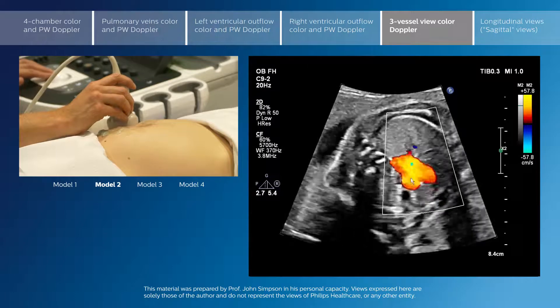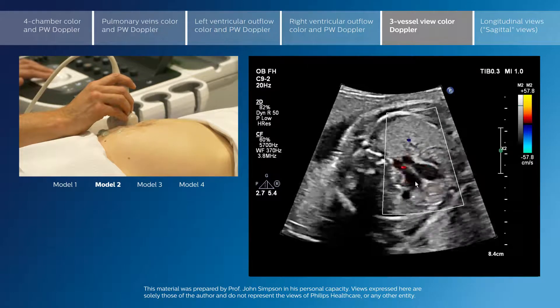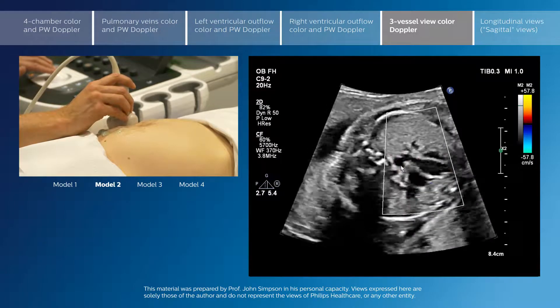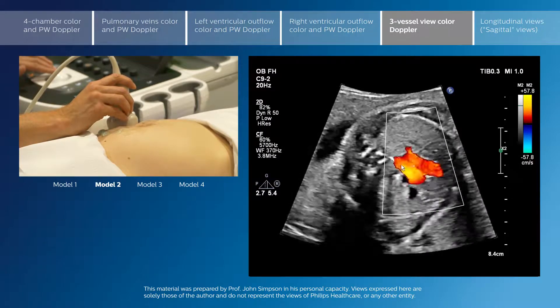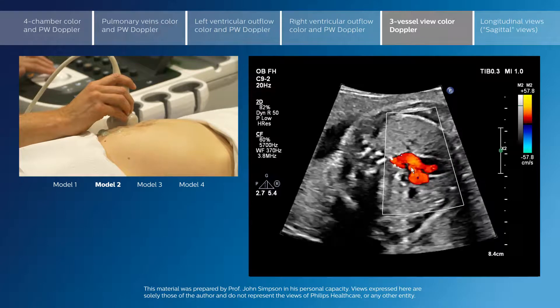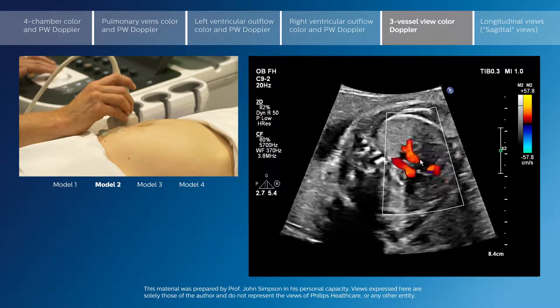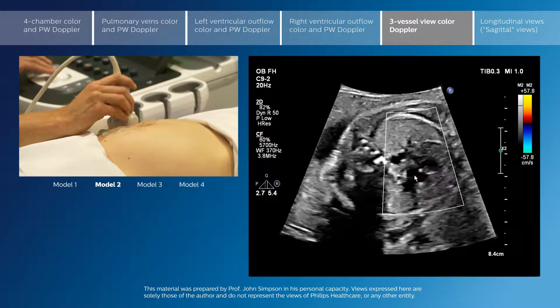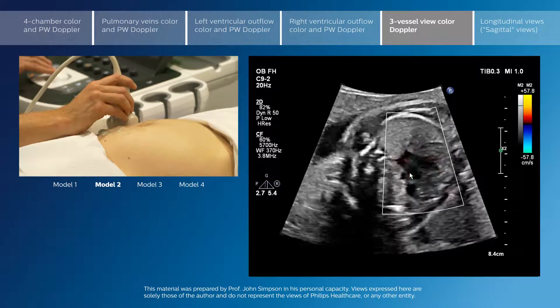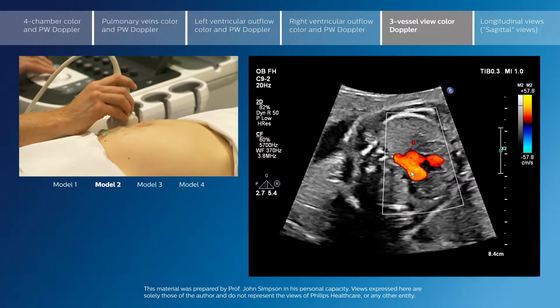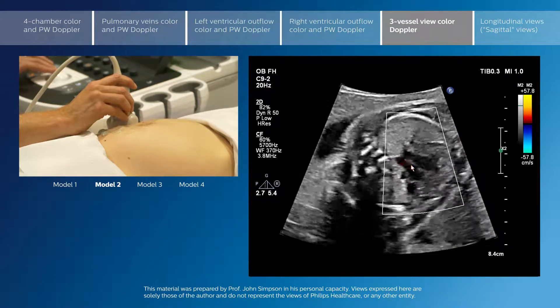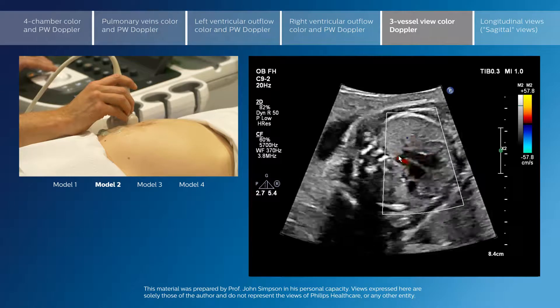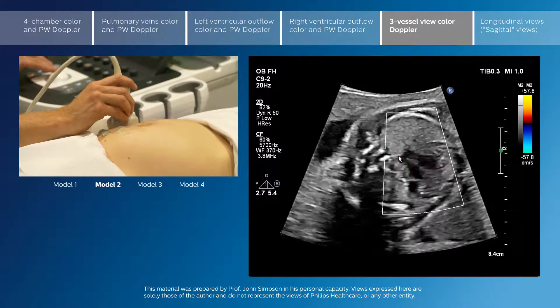Superiorly into the three-vessel view, we see red antegrade flow in both the ductal arch and the transverse aortic arch. The flow is from the heart to the descending aorta in both vessels.